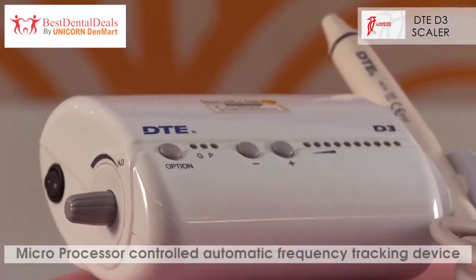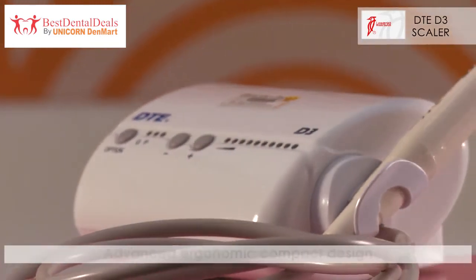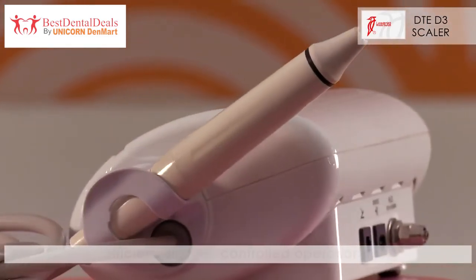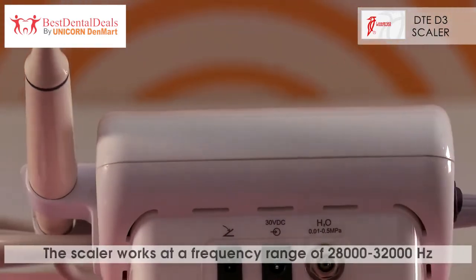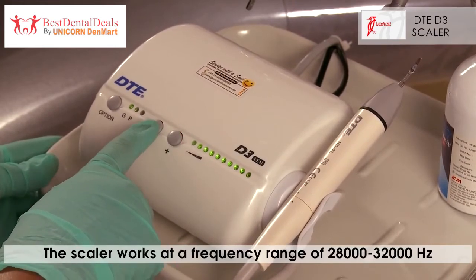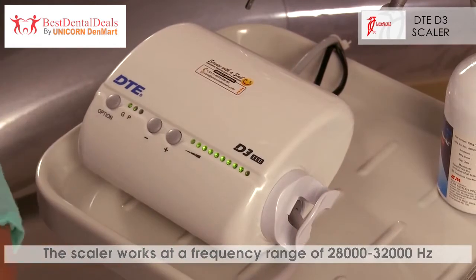The unit also has a microprocessor-controlled automatic frequency tracking device. It has an advanced ergonomic compact design with efficient digitally controlled operations. The scaler works at a frequency range of 28,000 to 32,000 Hz, assisting the user to work effortlessly.